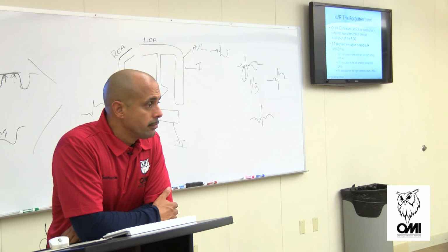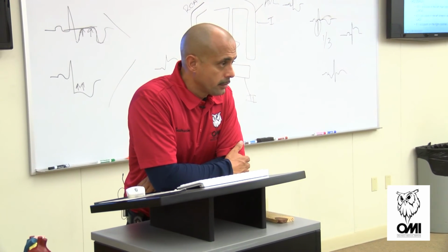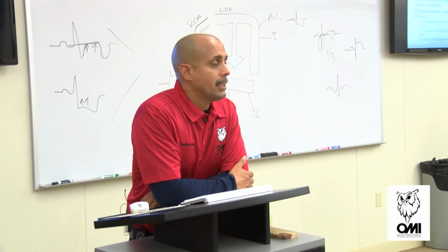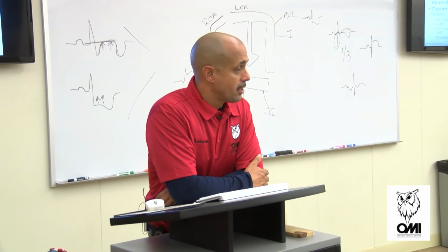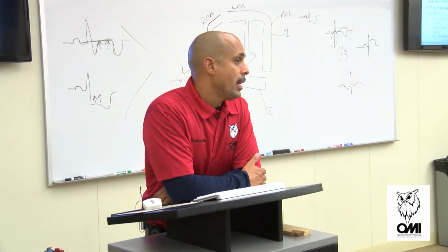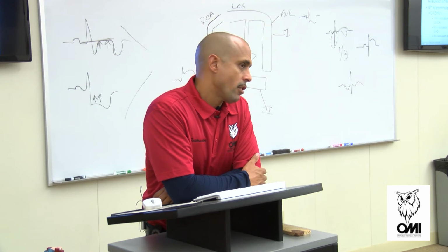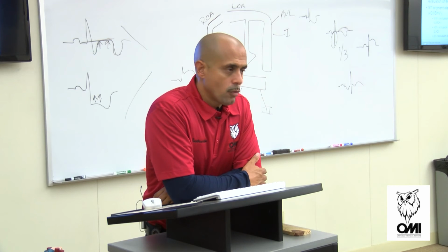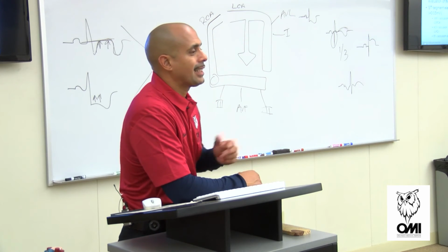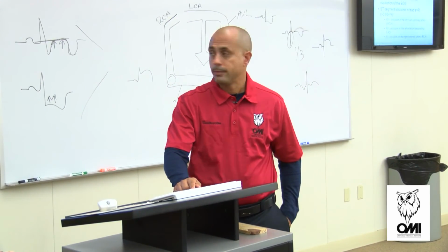But you said earlier that we need to classify as a STEMI, correct. But that's one box. This is one lead, not one box. One lead. So that's why I'm here to tell you that there's new information that's out that says if you have elevation in AVR, you have an 80% chance it could be left main. So you could call it. Say, hey, I'm calling a STEMI based on elevation in AVR, possibly can involve the left main coronary artery. Can you do that? Sure. They know what you're talking about. And they understand that's the lead by itself. Okay? Is everybody with me so far?